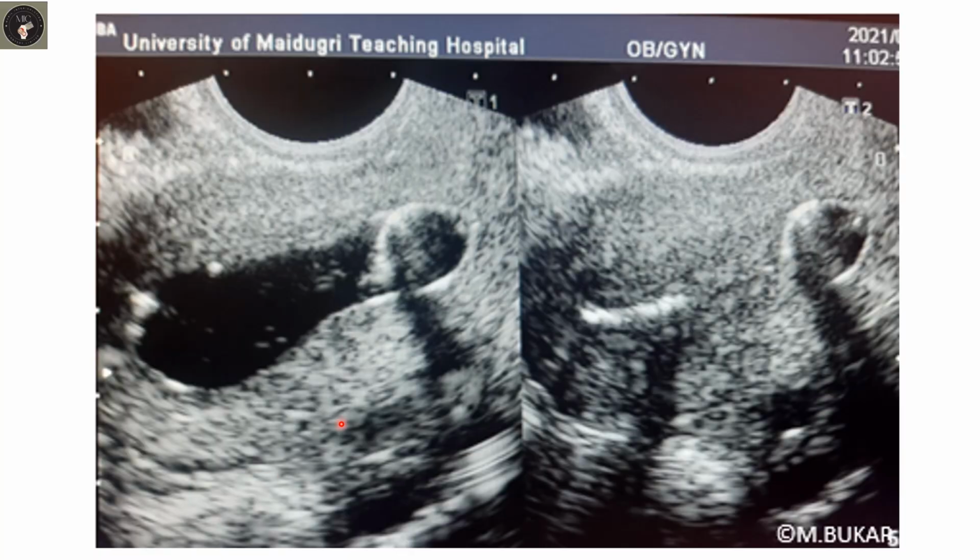So why is 2D SIS the first imaging modality of choice? Look at it. Pediatric Foley catheter, look at well distended endometrial cavity. So if there's any lesion here, the lesion will be obvious. So the first line non-invasive imaging modality for Asherman's is SIS using transvaginal imaging.